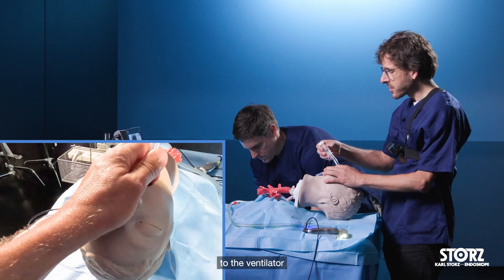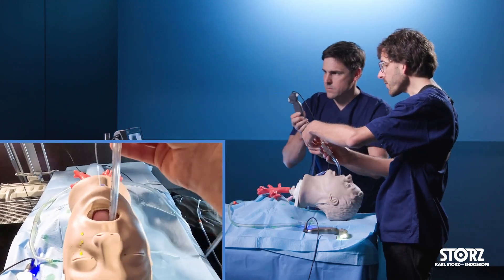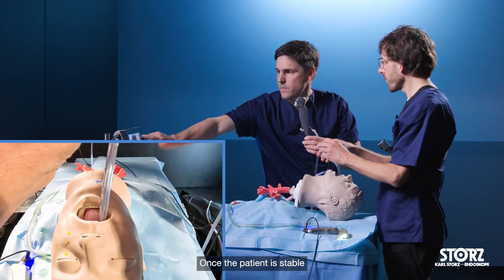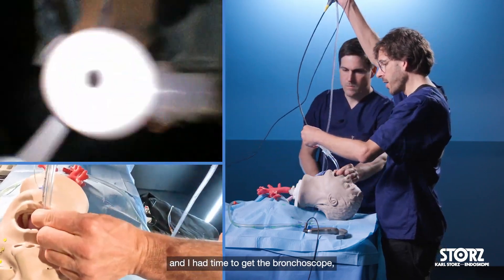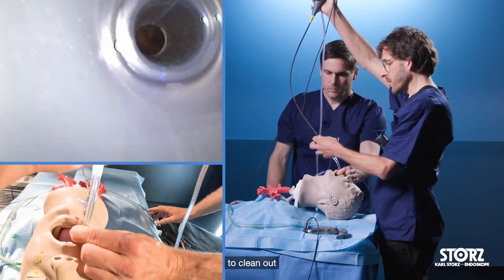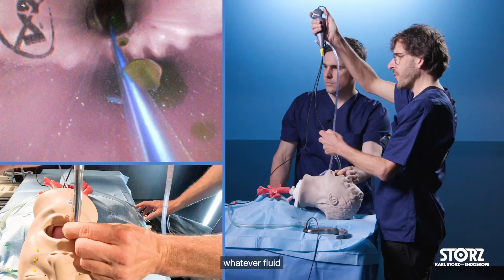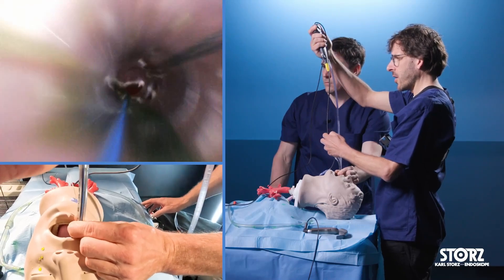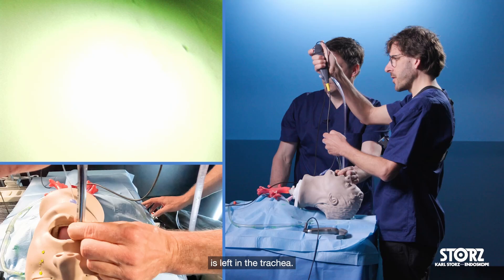I will hook up the patient to the ventilator and stabilize the patient. Once the patient is stable and I have had time to get the bronchoscope, I can use the bronchoscope to clean out whatever fluid is left in the trachea.